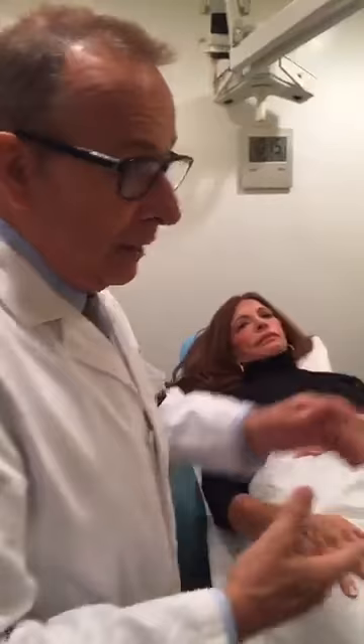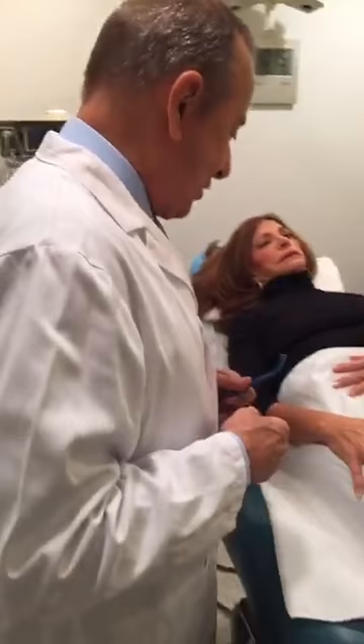How would this procedure work on legs? Very well, extremely well — that's what we do all day long. We can take care of spider veins, small and mid-sized veins, and big veins. Surgery on the leg veins is not performed any longer. We pass a laser fiber inside of the vein and with laser energy we seal the vein. Local anesthesia, twenty minutes, go back to work.